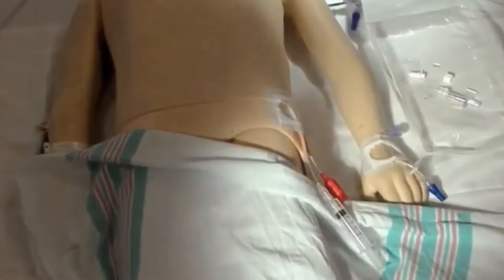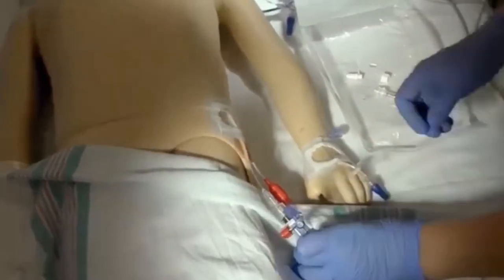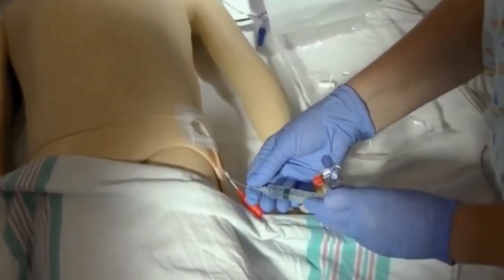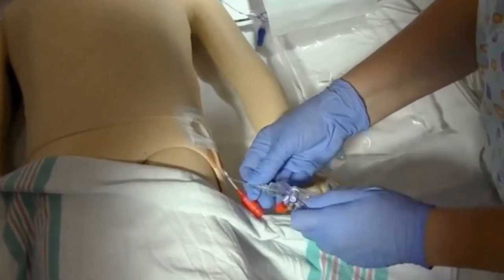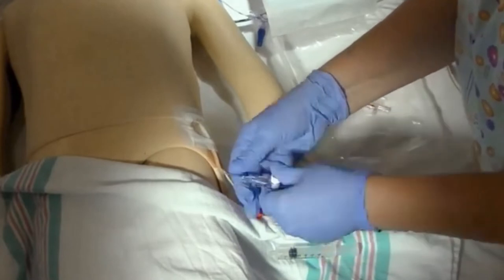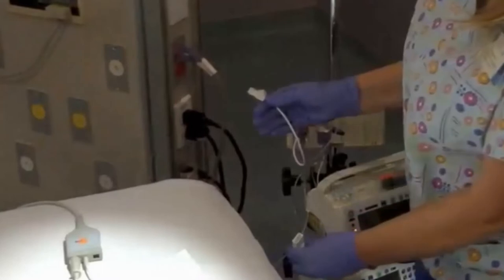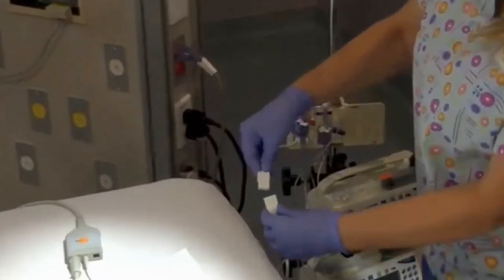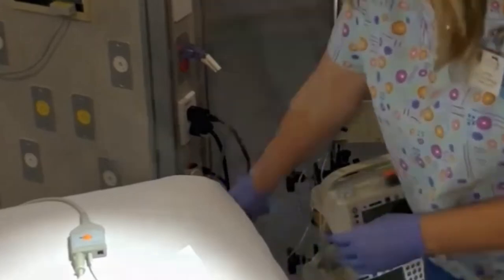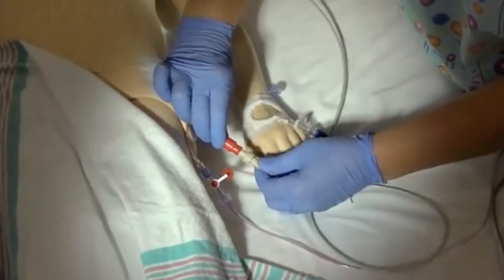Now let's get ready to connect the system with the already placed PiCCO arterial catheter. Verify blood return, flush, and clamp before disconnecting. Attach the transducer setup, then unclamp the tubing. Connect the transducer cable with the PiCCO pressure cable. And finally, connect the end of the thermistor cable to the red thermistor connector.